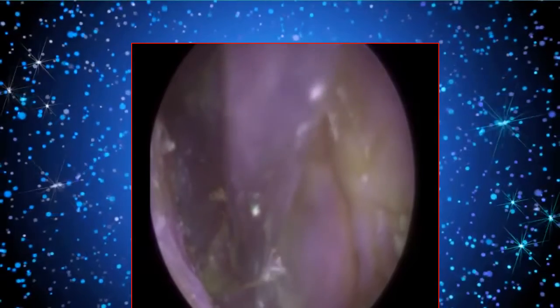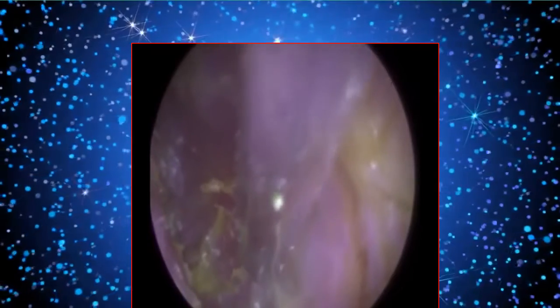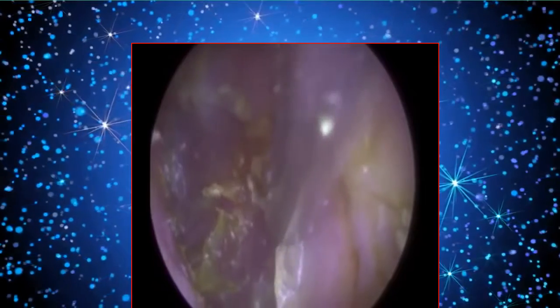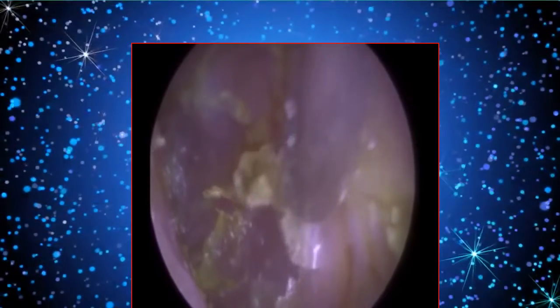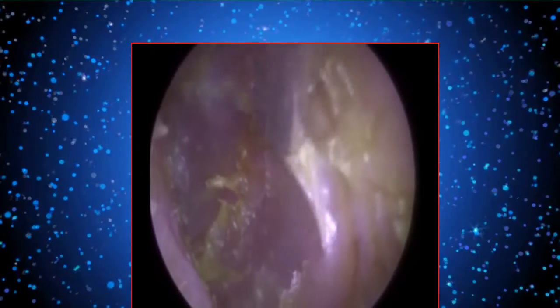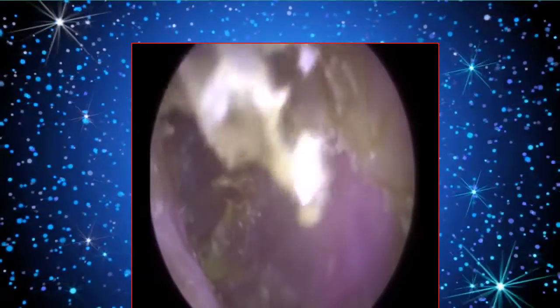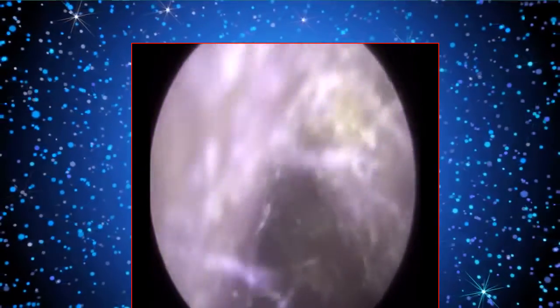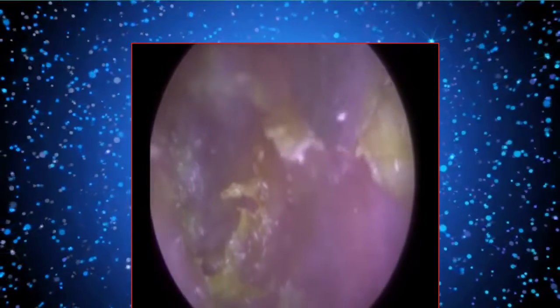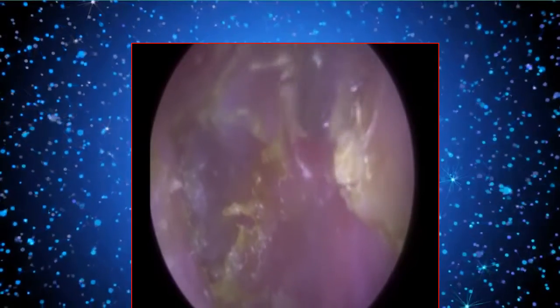So when we perform the procedure ourselves, I do anyway, I always keep one ear on the noise inside the ear, the suction probe. It can tell you a lot. So if it just goes mute, then you know it's blocked, so it needs to come out. If it's a loud sound and it goes quieter, so it's still audible but it's quieter, then we know we've got a suction grip and it's game on at that stage. So yeah, it just removes some dead skin posteriorly. So it's really important for the clinical ear care specialist to keep tabs on the loudness of the suction probe, because it does tell a lot.